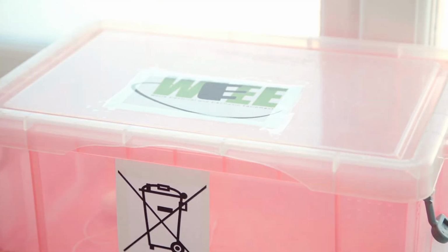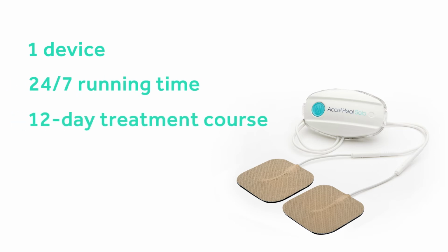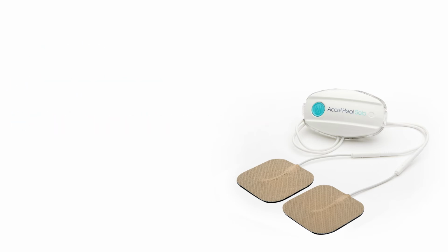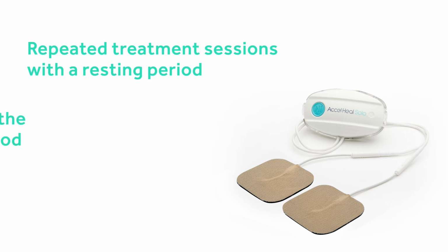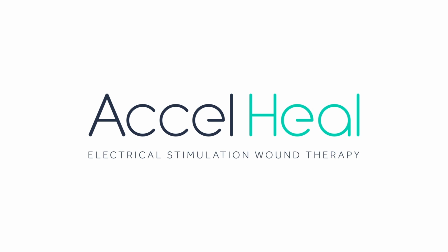The treatment consists of one device, making it a single 12-day treatment course. The Accel-Heal therapy delivers repeated treatment sessions with a resting period, which are repeated throughout the 12-day treatment period. Further instructional videos on device change and troubleshooting are available.